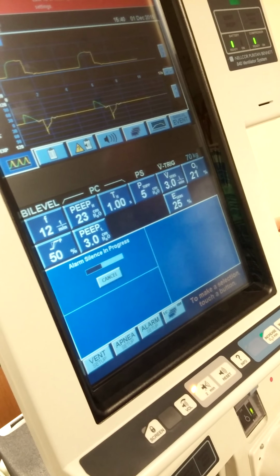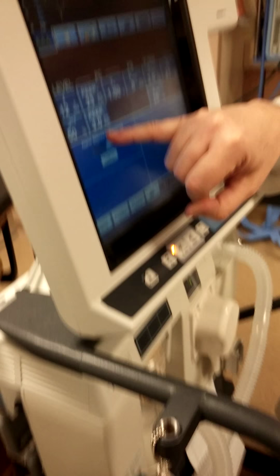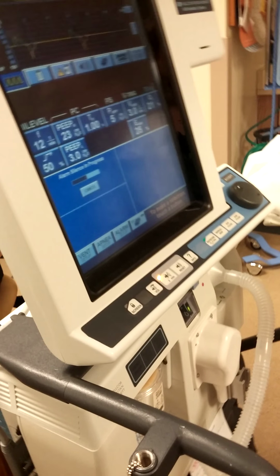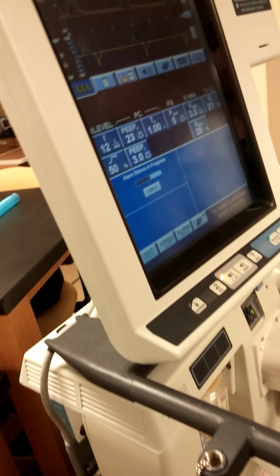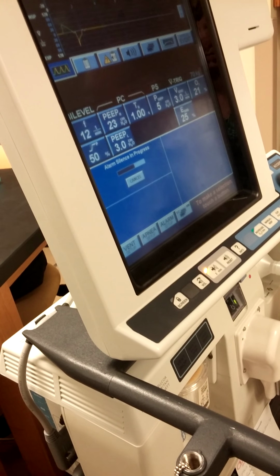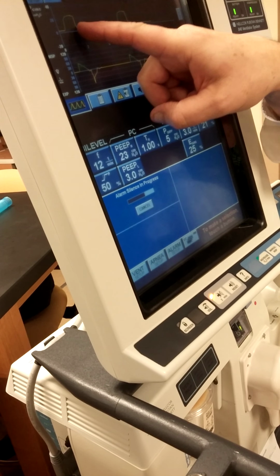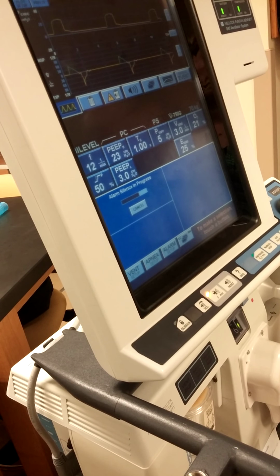Pressure control, right? Pressure support is only for spontaneous breaths, in reference to the low level. So I'm starting at 3, going up 5 to a total of 8, and it's only for spontaneous breaths, correct? Yes. Now, what I have written here, that if you want pressure support at high level then set at 25, no, we're not there yet. That's when we're talking about APRV. Right now, in that 1 second, you typically aren't going to have a spontaneous breath.